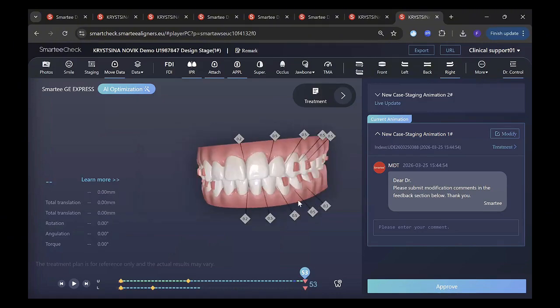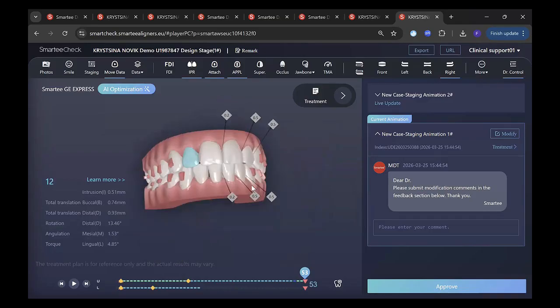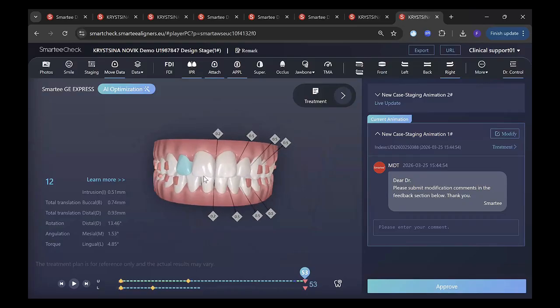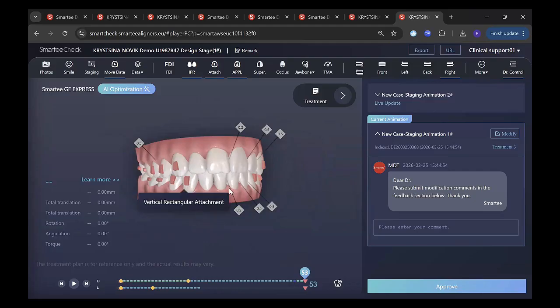Actually, it's a kind of marketing point. So the patient will take the decision while he's in the visit in the clinic. Then he will decide to do the aligner at that moment, instead of going shopping outside.